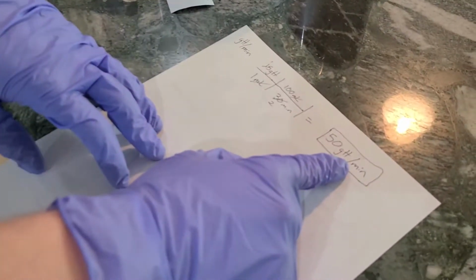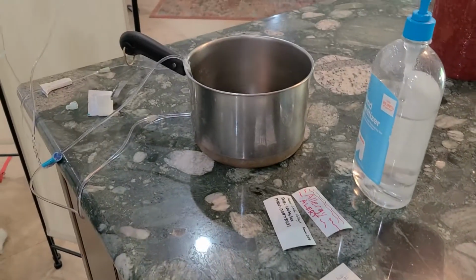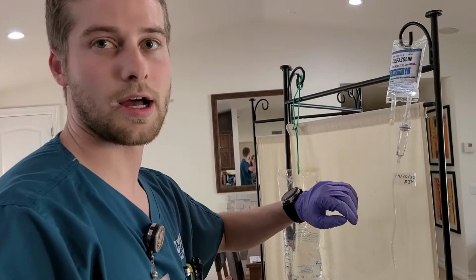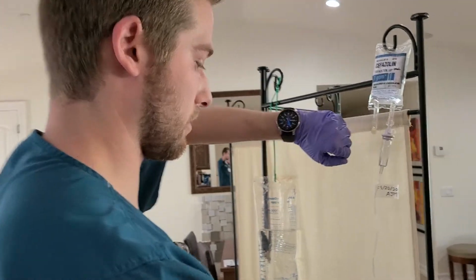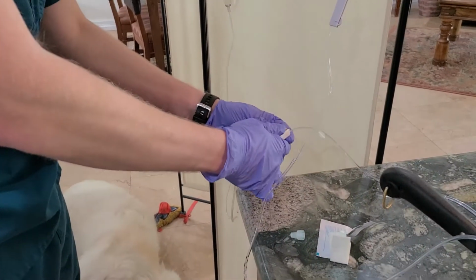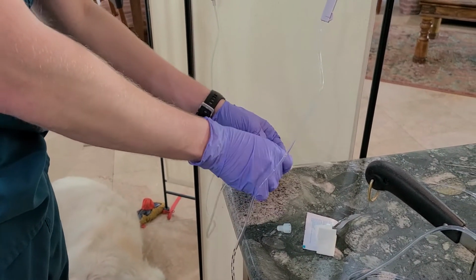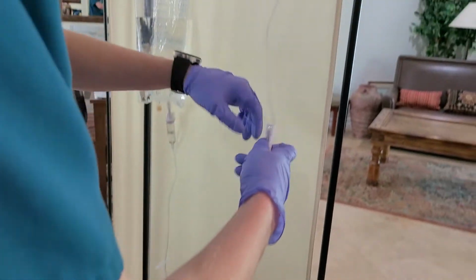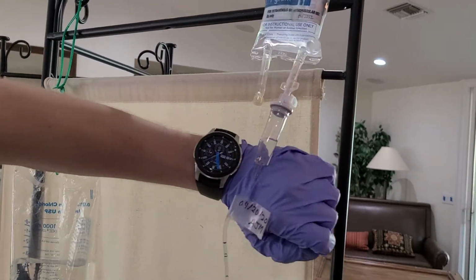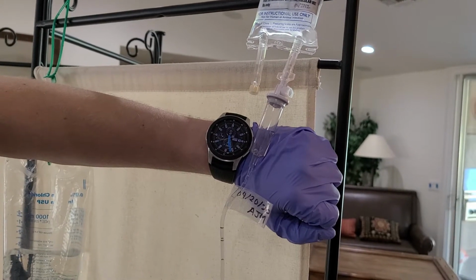I'm going to make sure that it's hanging for, or we're going to set it for 13 drops for every 15 seconds. So I'm going to calculate it here. Oh, before I do that, I'm going to make sure I clamp off the primary tubing. So now I'm going to unclamp this, and I'm going to make sure that I do it.